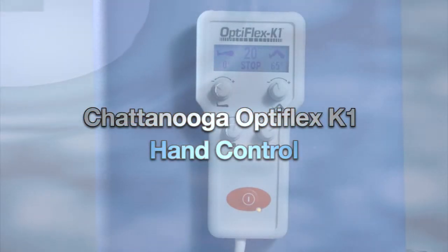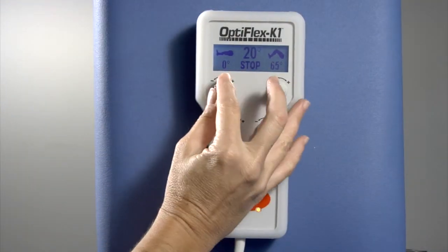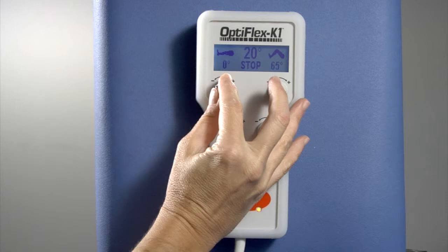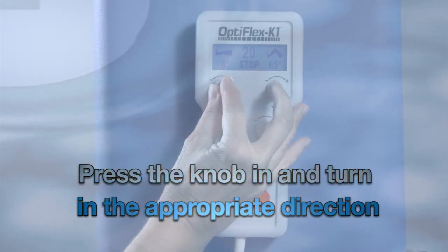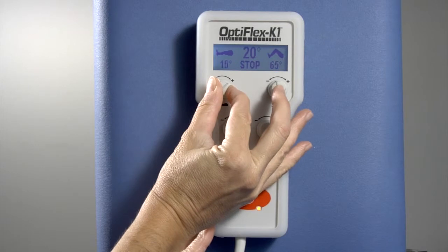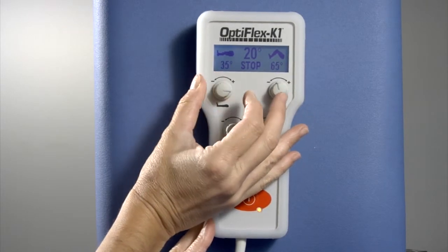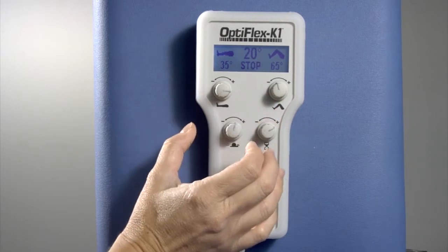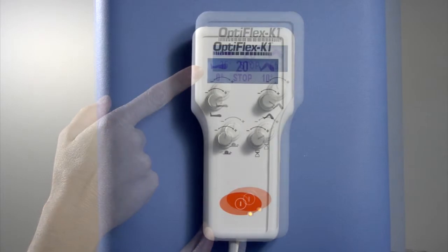The range of motion on the Optiflex K1 will run from -10 degrees of extension to 120 degrees of flexion. To adjust the extension limit to your prescribed or desired limits, use the extension knob symbolized by the picture of a straight leg. Push the extension knob in and turn in the appropriate direction. Note on the hand control that the extension setting is on the left side of the display.